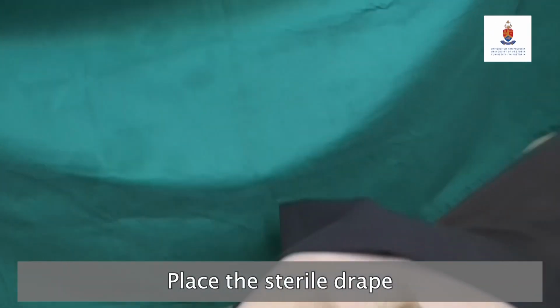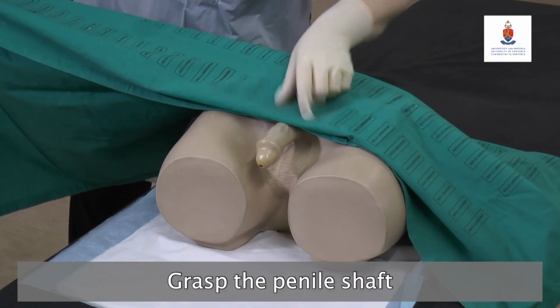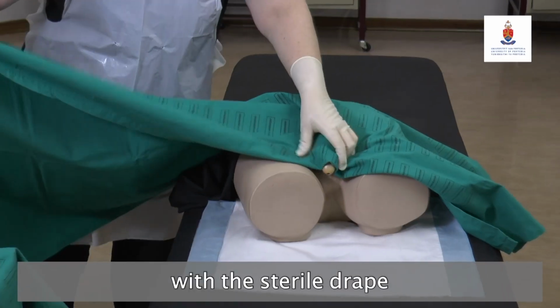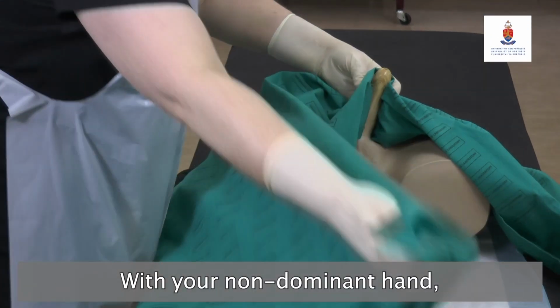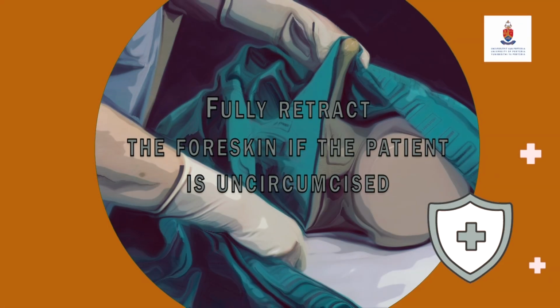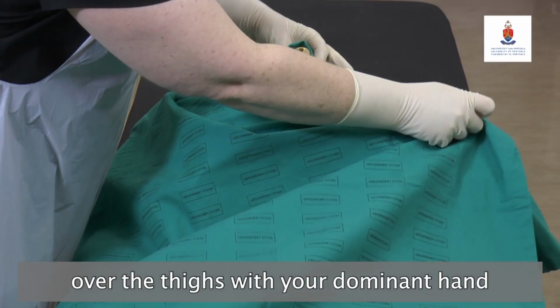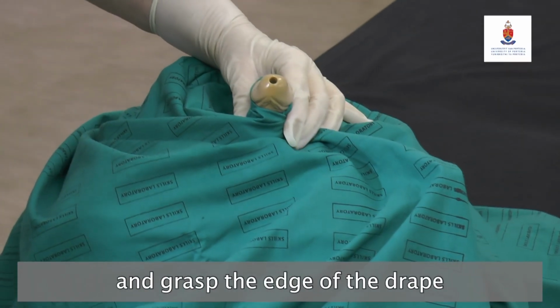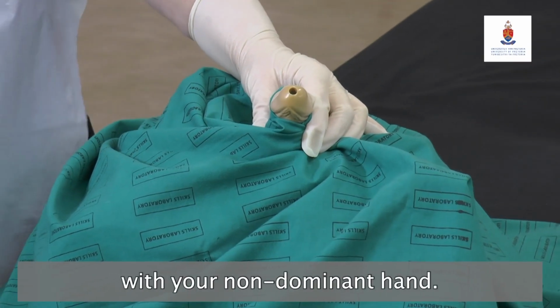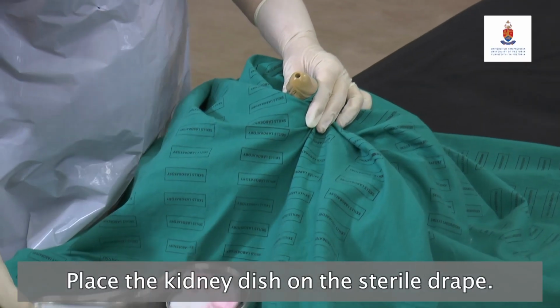Place the sterile drape straight over the pelvic area of the patient. Grasp the penile shaft with the sterile drape with your non-dominant hand. Fully retract the foreskin if the patient is uncircumcised. Fold the rest of the sterile drape over the thighs with your dominant hand and grasp the edge of the drape with your non-dominant hand. Place the kidney dish on the sterile drape.